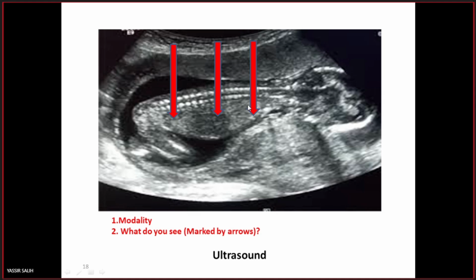Fetus. This is a fetus. What is this part of the fetus? The abdomen. Yes. The posterior. This is the posterior. Imagine its shape, as if it is lying down on it. This is the back. So what is this? Spine. Vertebrae. Yes, this is the spine. And this is the abdomen.